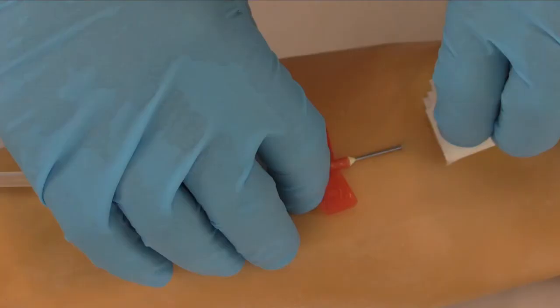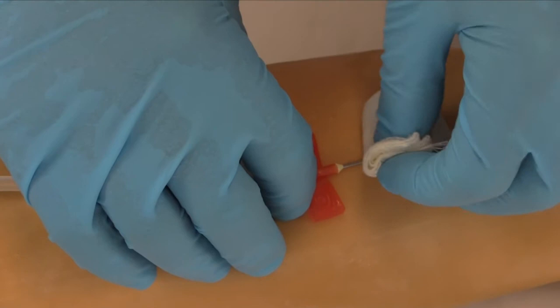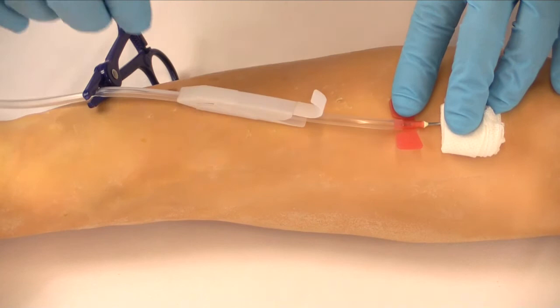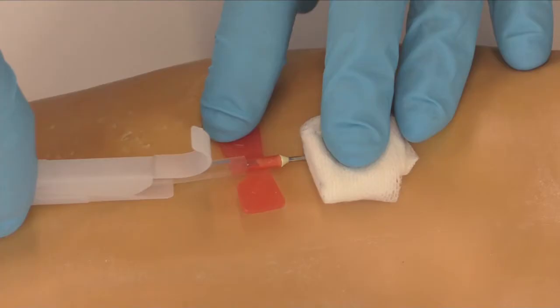Identify the venipuncture site. Place hemostasis dressing over the venipuncture site and gently hold it in place. Do not apply hemostasis pressure until the needle is removed from the insertion site.